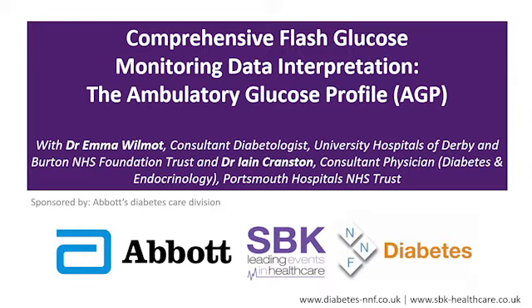Oh, well, you must remember to take your insulin then, mustn't you? I think what we should be trying to do in this sort of advisory process is saying, okay, what's usually happening and how can we tweak what's usually happening to be something that you will find a more comfortable and more effective strategy. So it's looking at what that normal is doing. That's the power of an AGP. And one of the reasons I love the projection is because of the darkening shade as it gets nearer the median, you automatically have this stress on the norm rather than the extremes. For me, that's one of the biggest powers around that projection, to be honest.